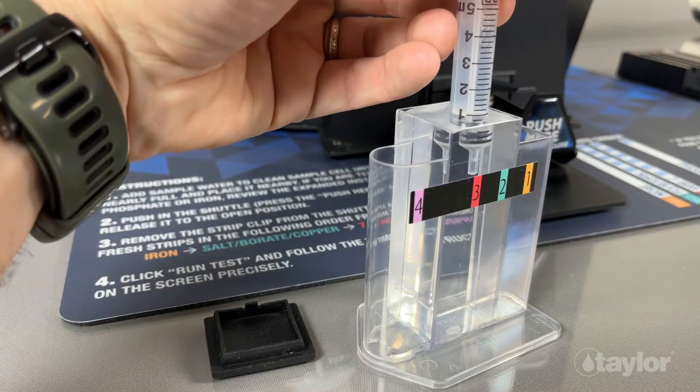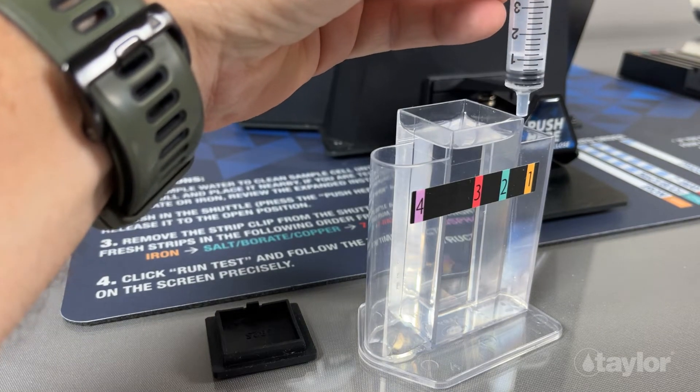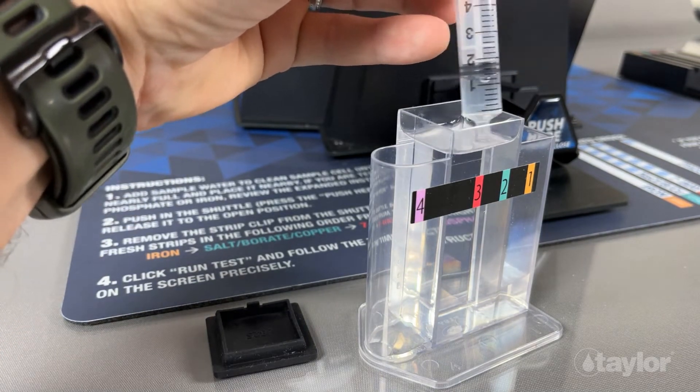Use the syringe to collect 5 ml of sample water from the main chamber and add to the iron chamber. Repeat this process for the phosphate chamber.